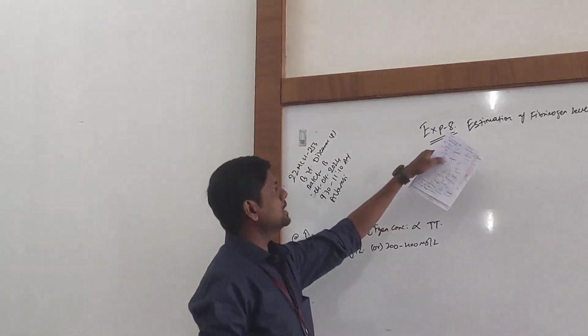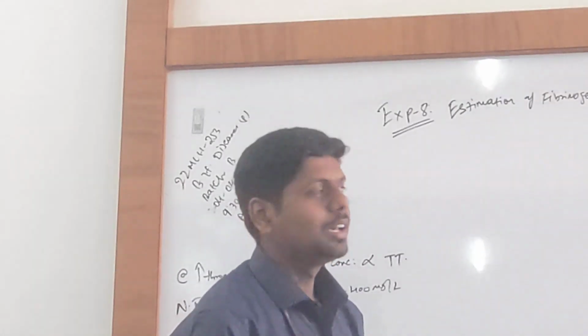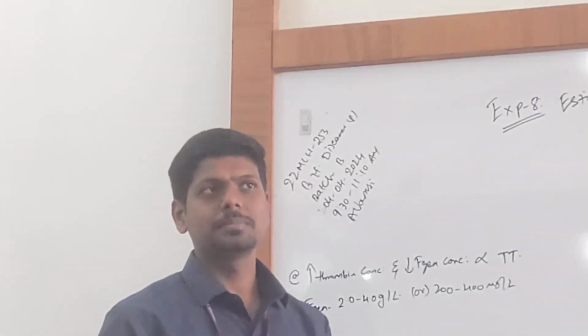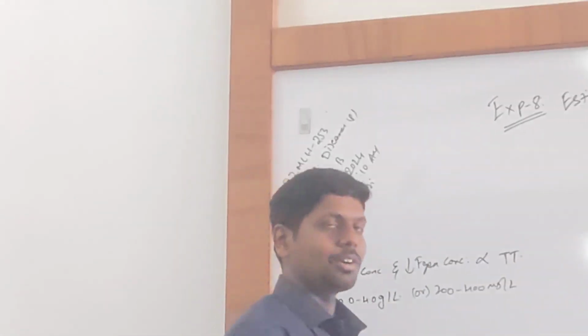So today's test is about estimation of fibrinogen levels. So what is the use of fibrinogen? Can you tell me? It will clot the blood, right? So fibrinogen is involved in clotting of blood.